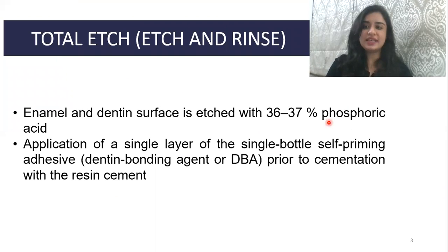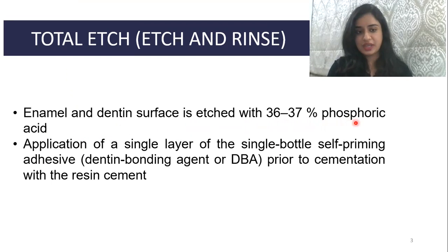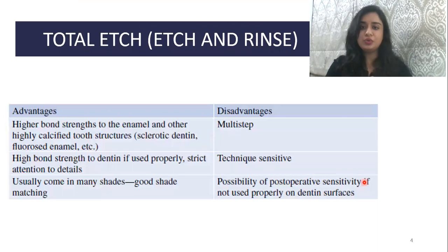Now, total etch, that is etch and rinse. In that, we have the enamel and dentin surface, which is etched with 37% phosphoric acid. Along with that, there will be application of a single layer of a dentin bonding agent prior to the cementation with the resin cement. When to use etch and rinse resin cement?